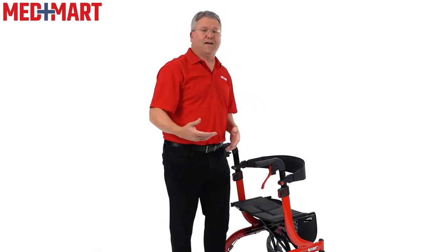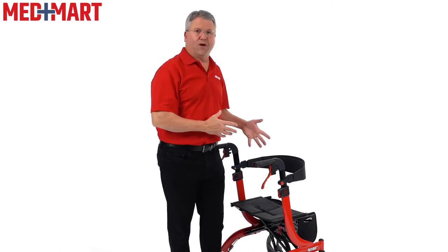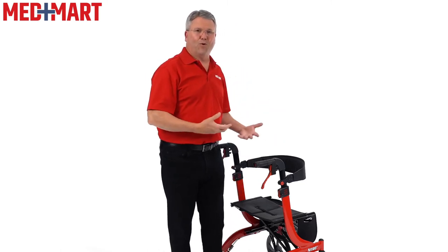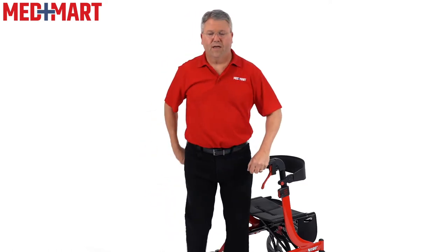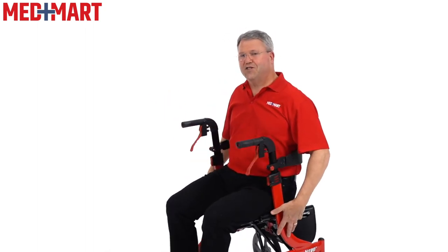One thing I always like to caution customers about when buying a rollator is making sure they understand that this is not designed to be a rolling wheelchair. The way you want to use it is to lock the wheels in place, sit down, and be in a stationary sitting position. The frame is not designed to use your feet and walk around like you could with a wheelchair. If that's something necessary for you, you're probably going to want to go with a standard wheelchair.